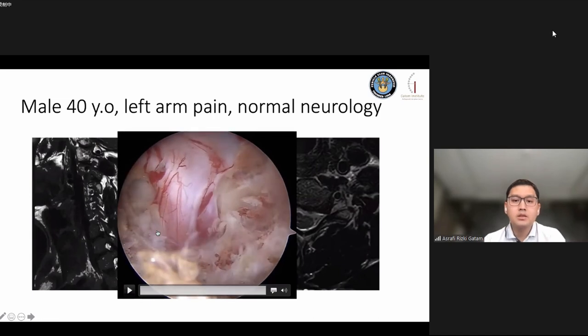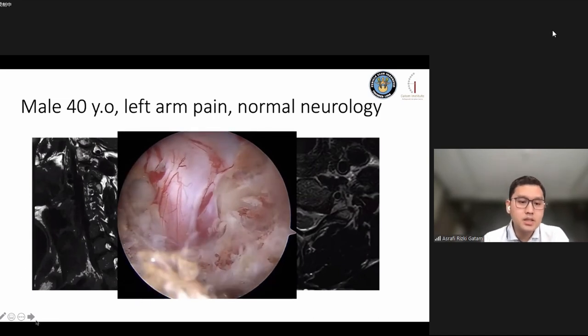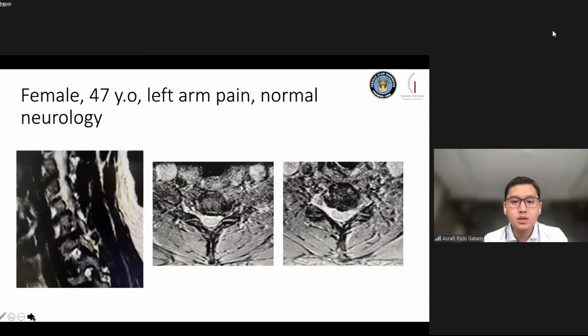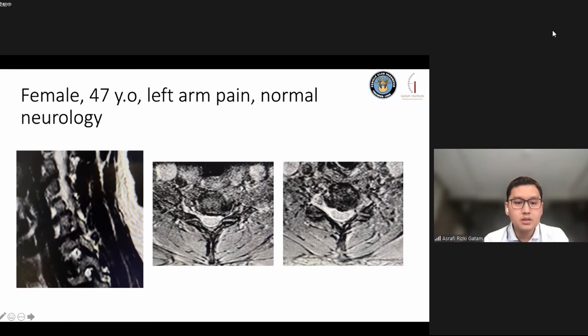The space available for discectomy is very small, so we drill out a small part of the superior pedicle to access the intervertebral disc. Using a dissector, the disc herniation is removed. The disc herniation in the cervical spine is actually quite small compared to the lumbar spine.